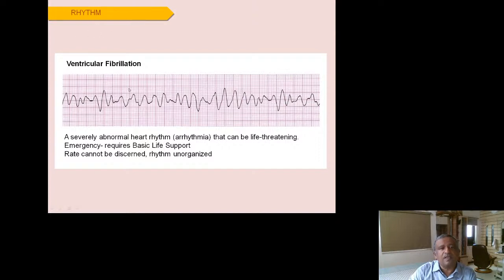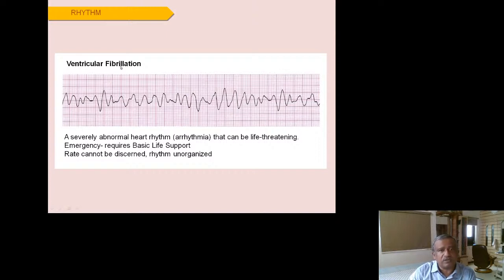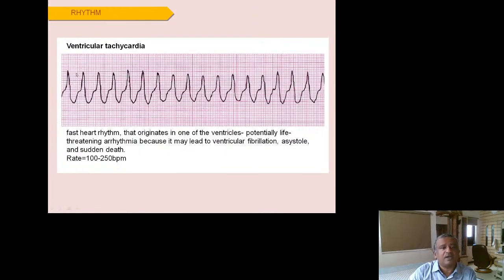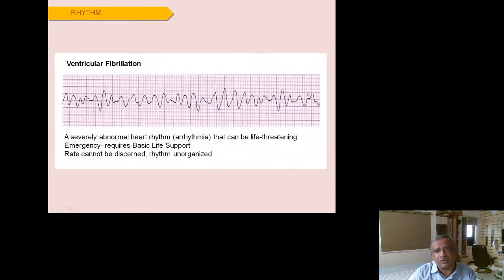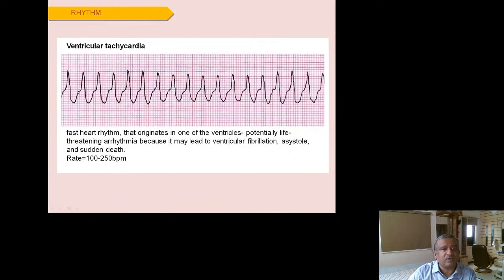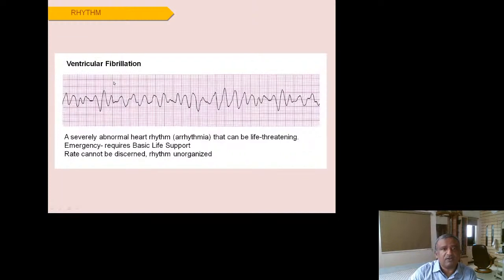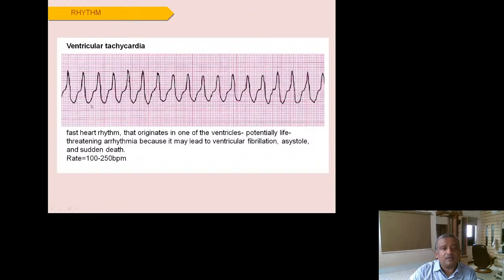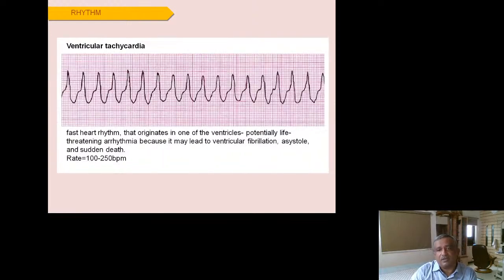Ventricular fibrillation is a life-threatening condition showing a totally chaotic rhythm with broad QRS complexes of varying amplitude. The patient will most likely have no palpable pulse. Ventricular tachycardia also shows a broad QRS complex but is more regular — if you draw a baseline, the complexes in VT are of equal length and depth, whereas in VF they vary chaotically. VT rate is around 100–250; the patient is mostly pulseless. DC shock should be given as fast as possible.